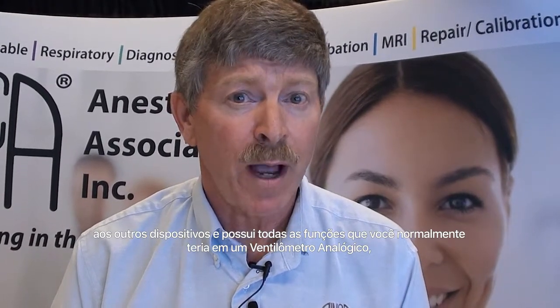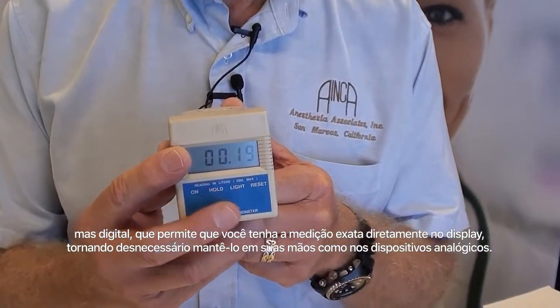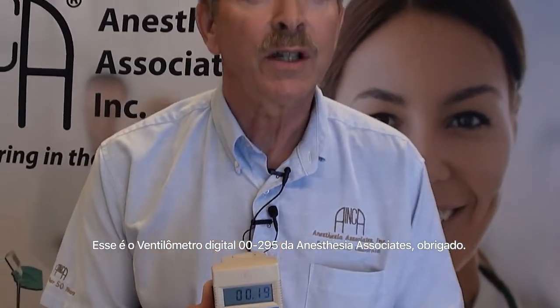The device is very rugged. It's made of noryl plastic, so it's a little more bounce-resistant than most other products available. It performs all the functions you would normally have in an analog respirometer, but in a digital sense — the display allows you to read the number directly versus having to infer values from the hands of an analog device. Again, this is the Anesthesia Associates 00-325 digital respirometer. Thank you very much.